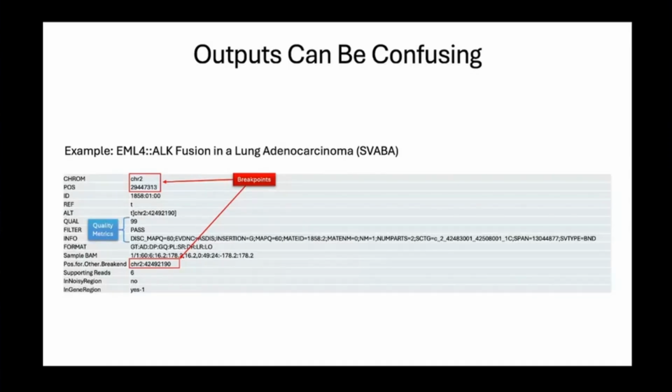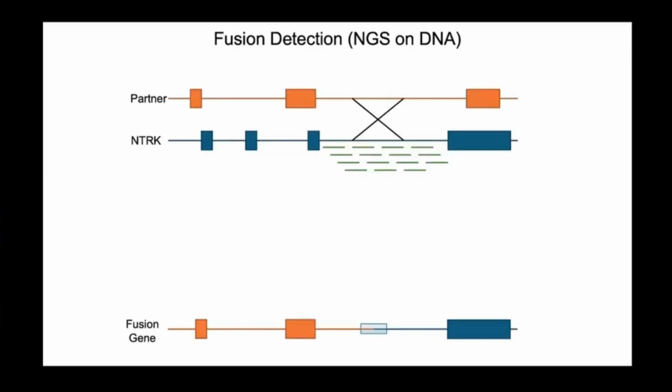But the quality metrics are highly variable, even if you sequence the same sample library twice. So we have ended up with a situation where we have kind of less than optimal sensitivity and specificity, which is what multiple labs are dealing with. This is a particular issue for detection of fusion genes by targeted sequencing of intronic breakpoint hotspots, which is one of the things we designed the assay to do.